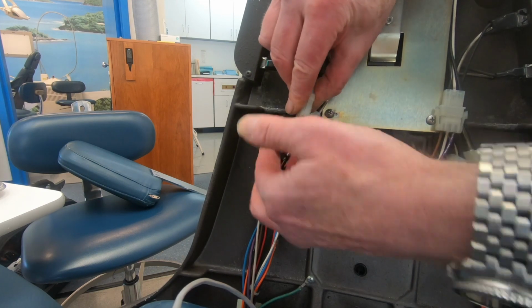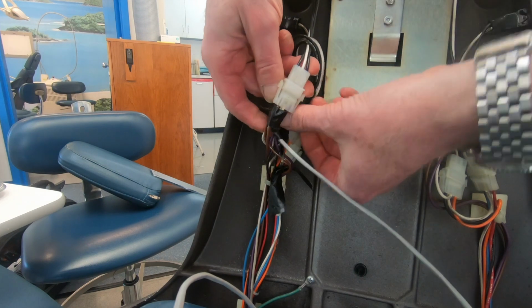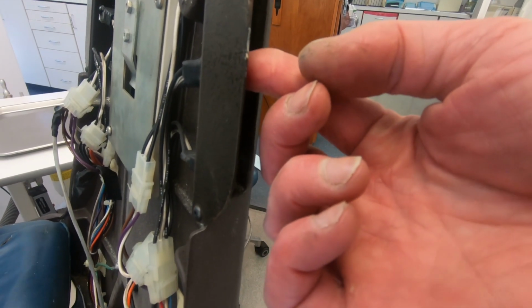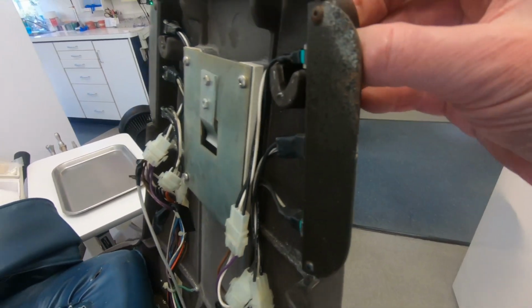So I'm just gonna take that gray wire off and do this permanently. That's the idea. And I'm doing it with Wago connectors, which work out really well. So now I'm just gonna raise the chair to give myself a little bit of clearance to work underneath. A lot easier when the chair is raised up.